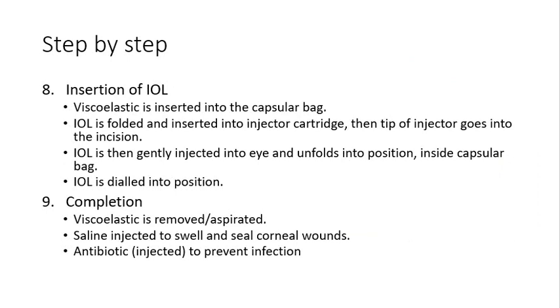Step eight is IOL placement. Viscoelastic is injected into the capsular bag. The intraocular lens is folded in half, inserted into an injector cartridge, and the tip of the cartridge is placed into the incision and gently injected into the eye. The lens unfolds into position inside the capsular bag and is then dialed into position as the surgeon maneuvers it to the desired location.